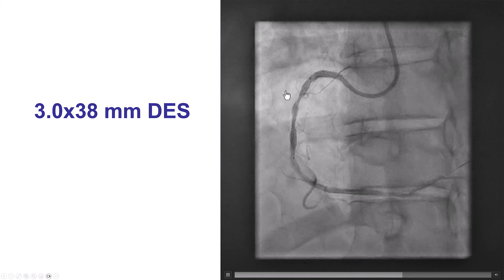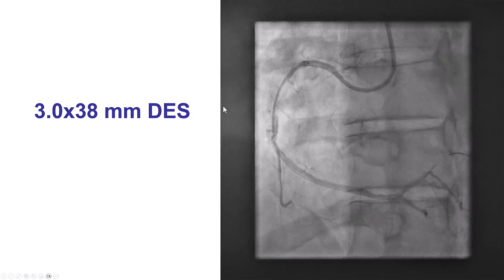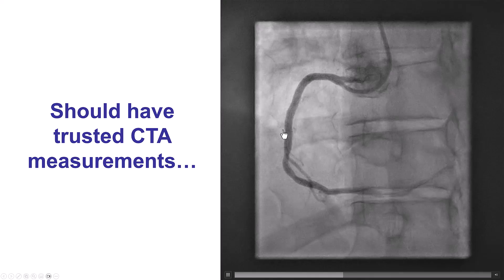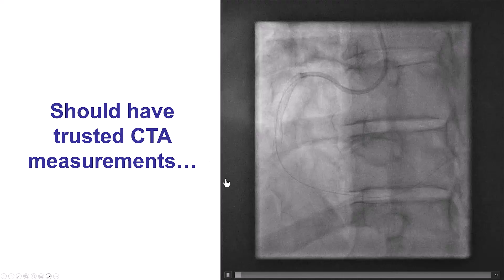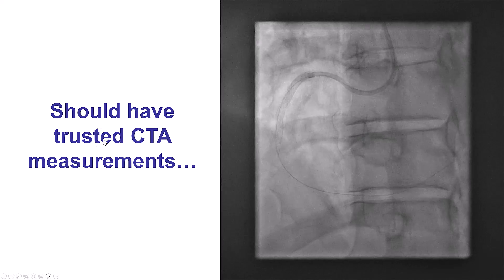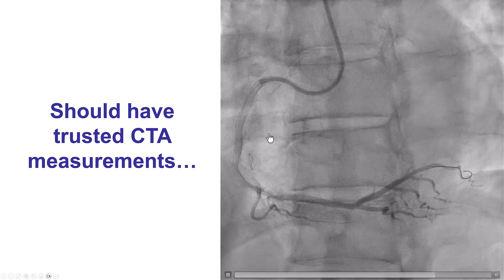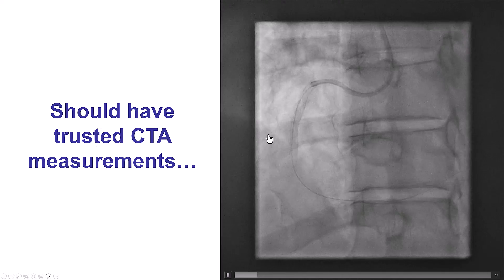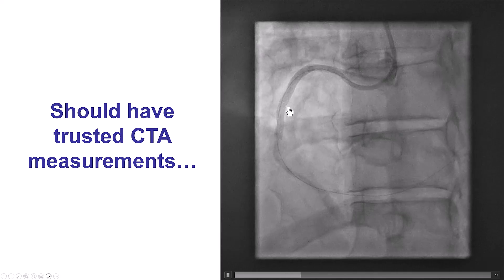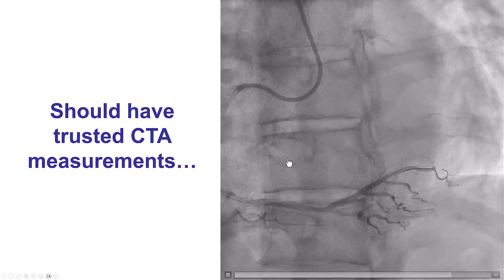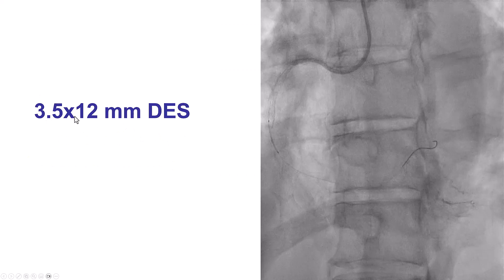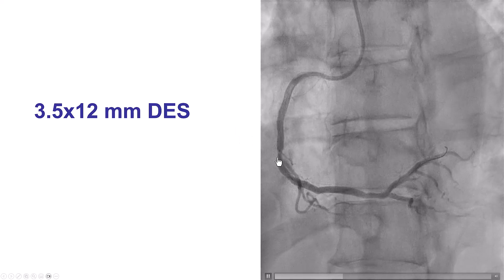We thought that a shorter stent at 3×38 mm would be enough, so we placed a 3×38 mm drug-eluting stent across the lesion of the right coronary artery. But the distal edge didn't look good because there was more plaque distally that we hadn't covered. This was a reminder that the CT measurement was 47 mm, so we should have probably placed a 48 mm stent. Instead, we asked for another stent and placed a 3.5×12 mm drug-eluting stent more distally.